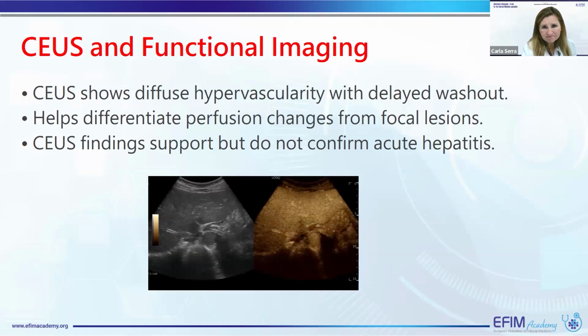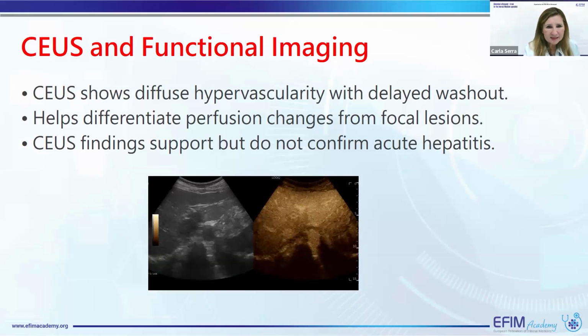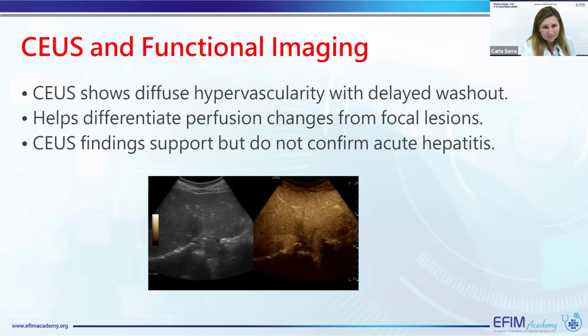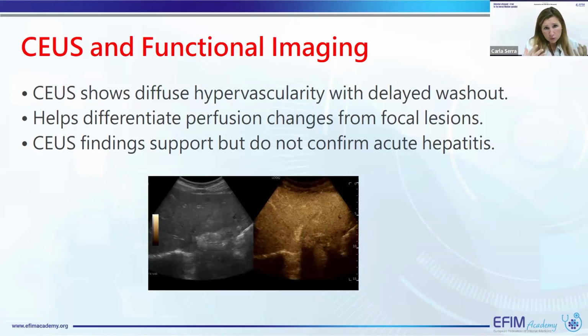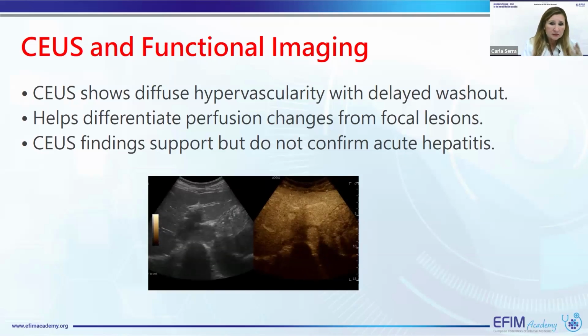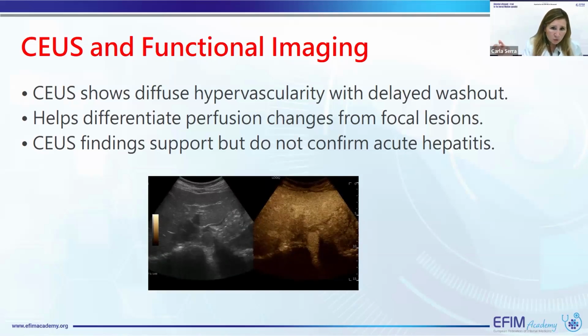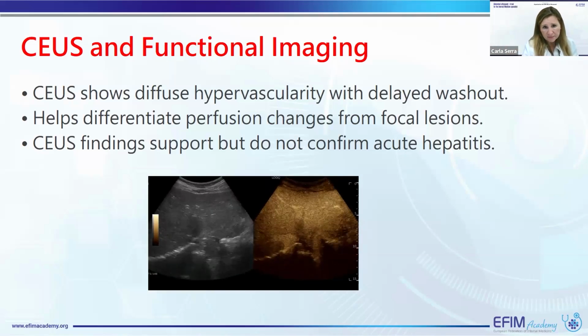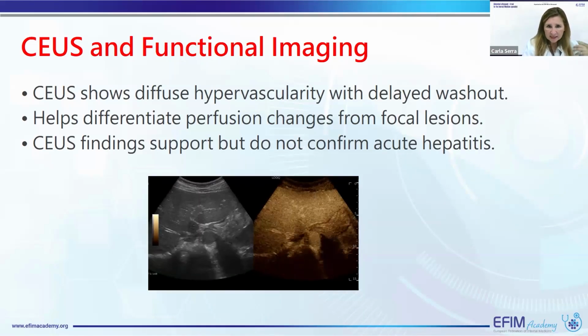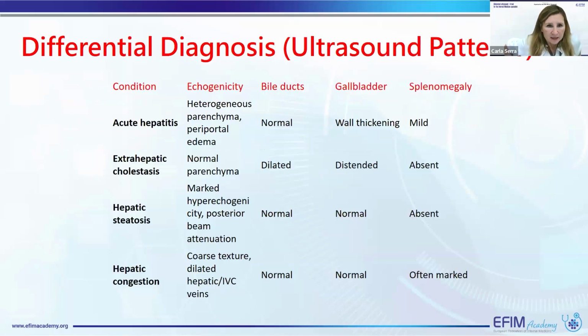We have not so much information with the contrast ultrasound, because sometimes the technique shows a hypervascularity with sometimes washout, but the only role is to evaluate the presence of focal liver lesions. To be honest, no more information about the liver parenchyma.